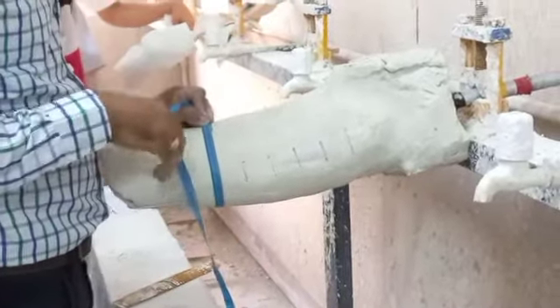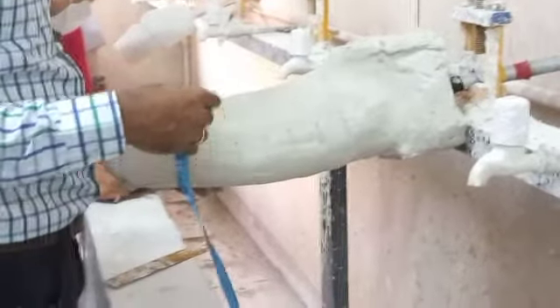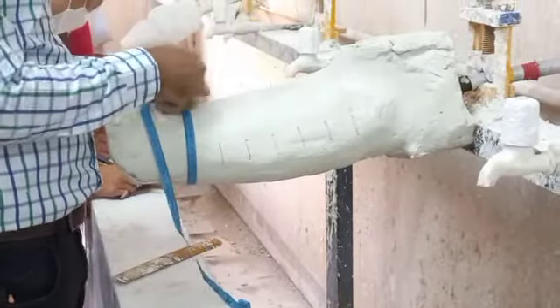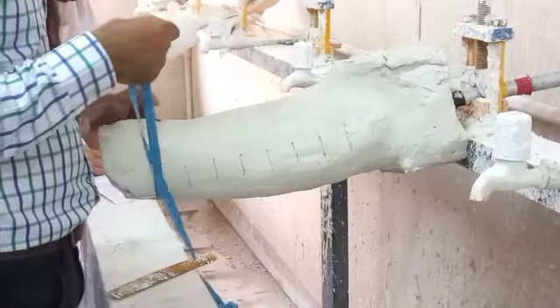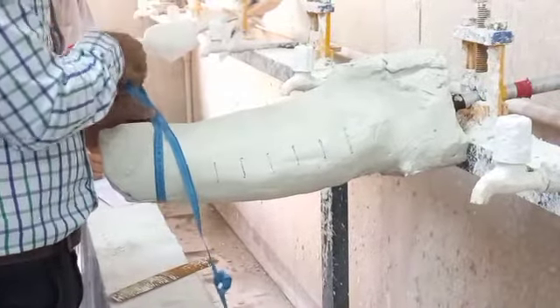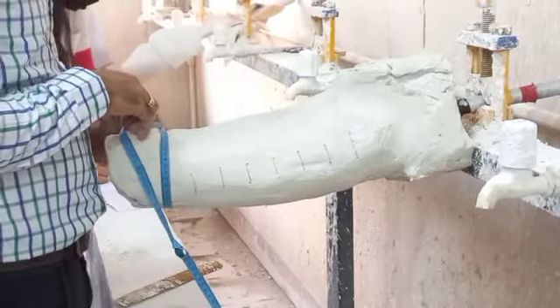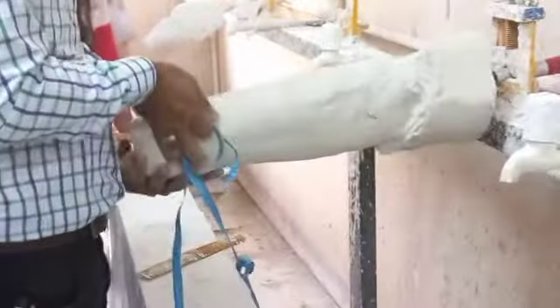Then it is 37.5. Then it is 35.8. And then the last measurement, just because the leg is starting here, is 35.4. Okay, so these are the measurements of the mold.